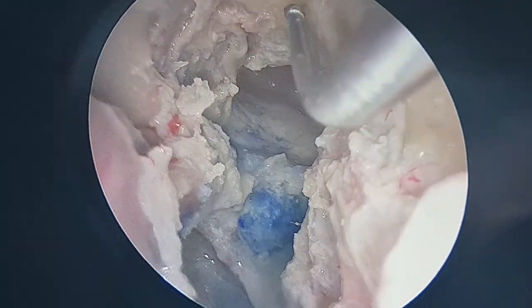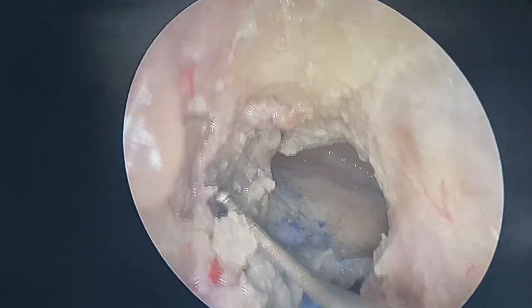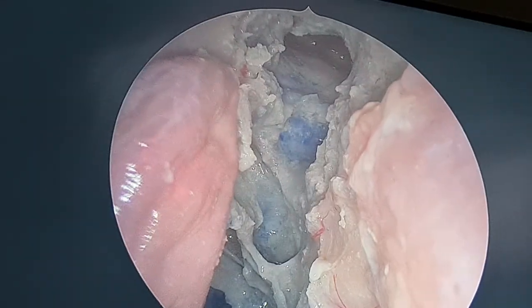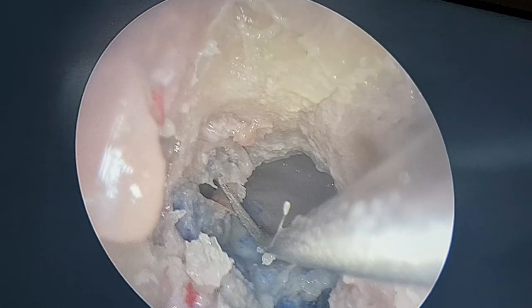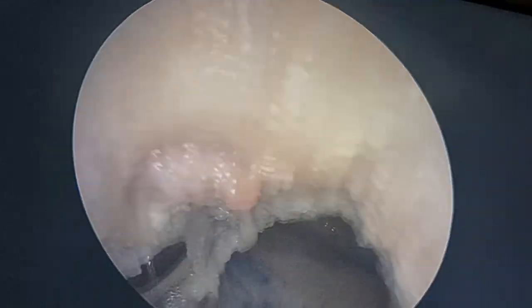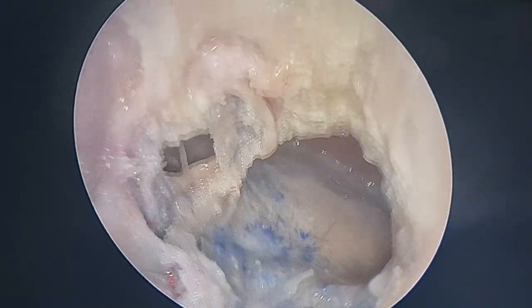Subtotal involves ipsilateral Draf 2 with intersinus septotomy and septotomy below. Both. Now, if I do an intersinus septotomy, take my shaver, remove this mucosa. See, I'm in the opposite frontal. If I remove this septum completely, my opposite frontal sinus can drain through it.